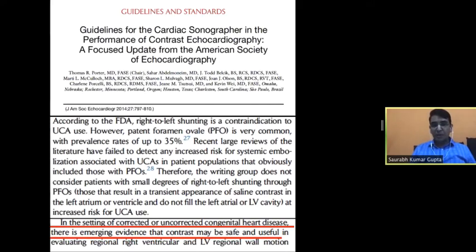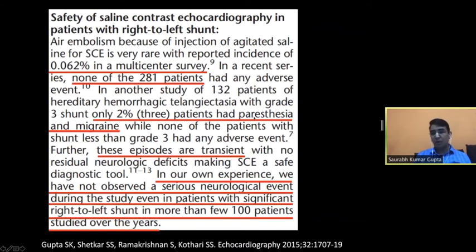Now, this is a statement which was published in the Journal of the American Society of Echocardiography in 2014. And it says the same thing which I just mentioned to you. In the setting of corrected or uncorrected congenital heart disease, there is emerging evidence that contrast may be safe and useful. Although they are more talking about commercial left-sided contrast, I think it practically also includes saline contrast echocardiography, because much of the evidence which they have included while putting these guidelines together also includes the era when saline contrast echocardiography was prevalent. And this is our own analysis, our own review, which was published in 2015.